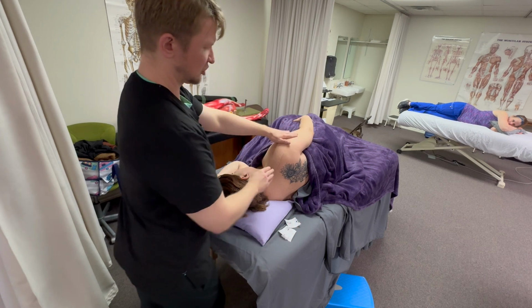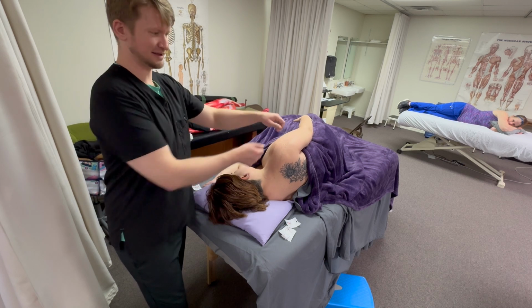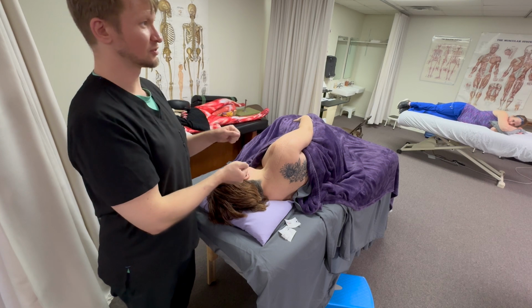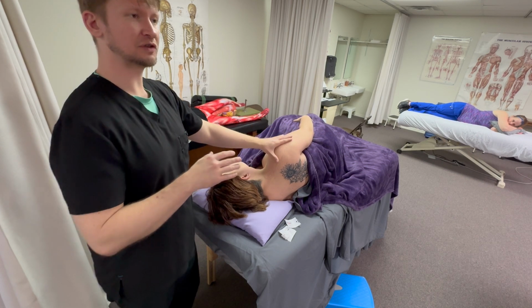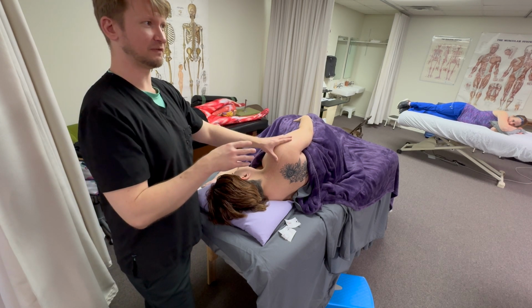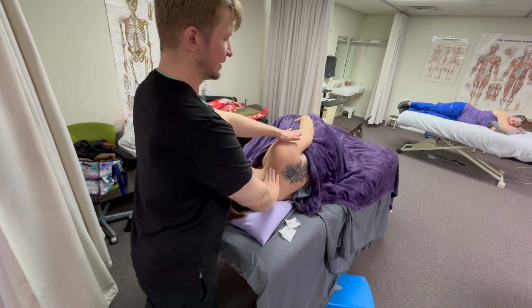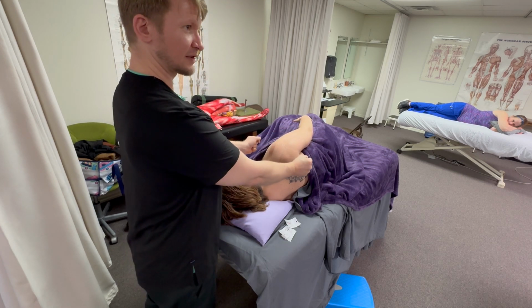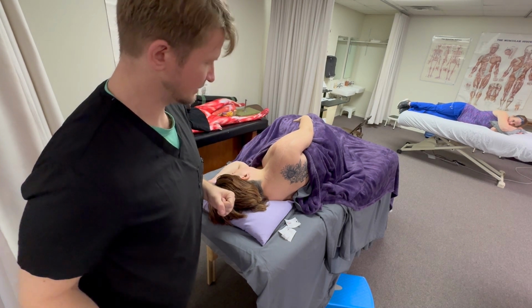I put a bit more tension there, partly to just make up the distance. I personally think that it's okay to go with a lot of tension when going over a joint. Just know that when you read other resources, they may say more like 50 to 75%. So around here, I have been braver with this one and especially the next one of doing a lot of tension.